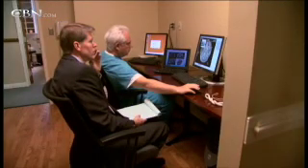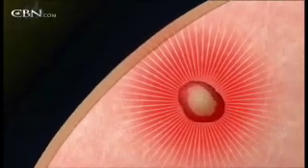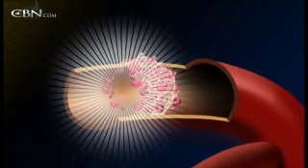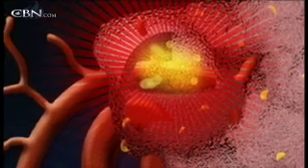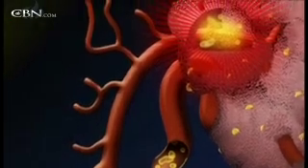Kassell is also working on ways to use ultrasound for a wide variety of brain tumors and diseases without a knife. The procedure also has great promise for controlling breast, prostate, and other cancers. We view it as a disease that has to be maintained and monitored in treatment. So a chronic disease instead of a fatal disease. One potential heart application is to zap life-threatening clots blocking blood vessels. Another possibility? Using the ultrasound beams to pinpoint and release injected medicine right where it's needed to fight tumors or promote healing. The rest of the body remains free of side effects.